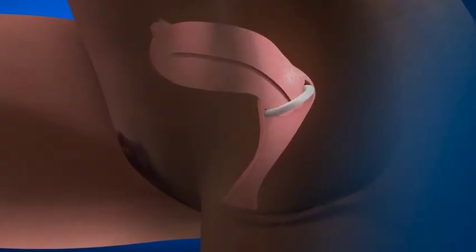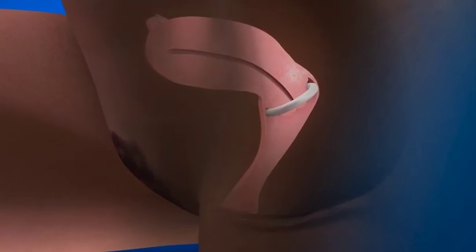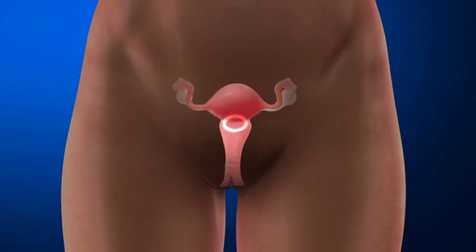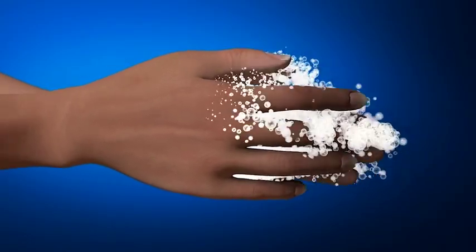If the ring is uncomfortable or painful, it might not be far enough. Try pushing it in further or removing and reinserting. If it still feels uncomfortable or painful, remove the ring and contact your clinic or doctor. After insertion, wash your hands in clean water and dry them.